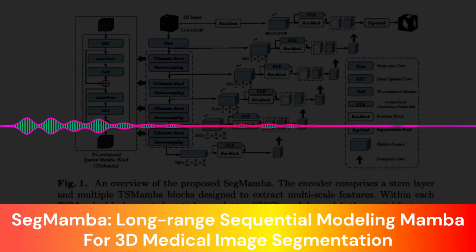But getting that level of detail automatically, well, that's been tough with the older methods, hasn't it? It really has. The standard approach, using convolutional neural networks, CNNs, they're good at finding local detail, small patterns. Right. But they often miss the bigger picture, how distant parts of a scan relate to each other. Even attempts to broaden their view, like using those big 7x7x7 filters in 3D UX-Net, help a bit, but it's still not quite capturing the full global context.